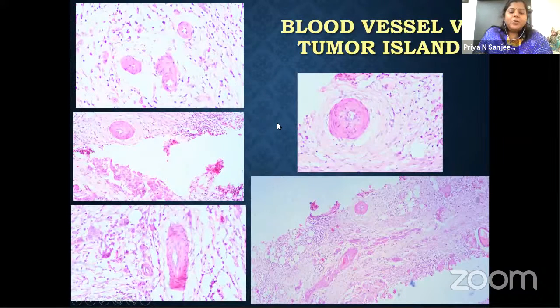So it is important to distinguish between a blood vessel and a tumor island because both appear a little similar in low power. So this is a blood vessel and these are the tumor islands. These are again blood vessels. So how do you differentiate between a blood vessel and a tumor island? Within the blood vessel, you can see the lumen and the endothelial lining, and you have a smooth muscle coating, and they are normal appearing cells. Again, look for the lumen and endothelial lining, which is like blue dots, the nuclei of the endothelium. Here the blood vessel is cut at an angle, so it appears a little elongated.